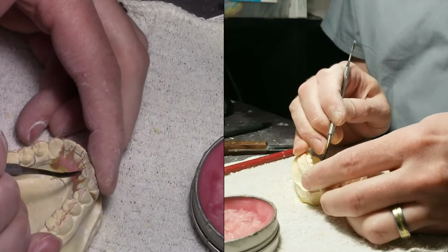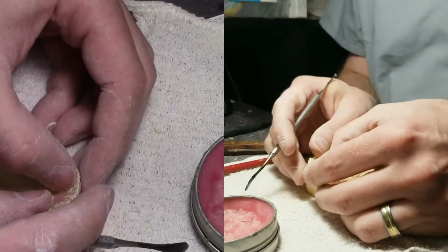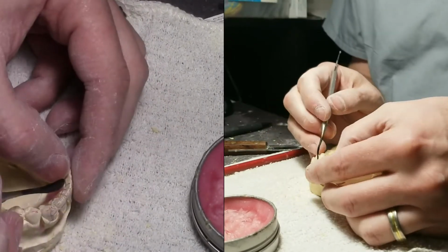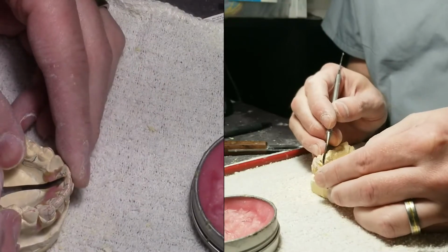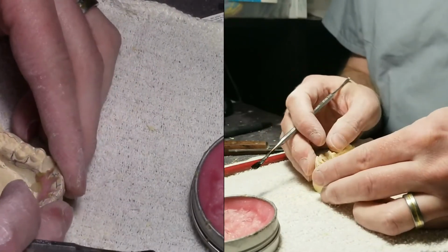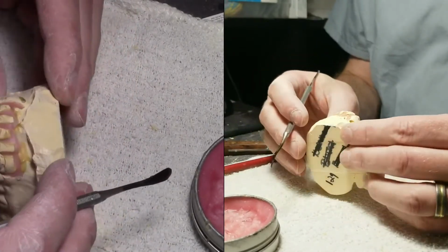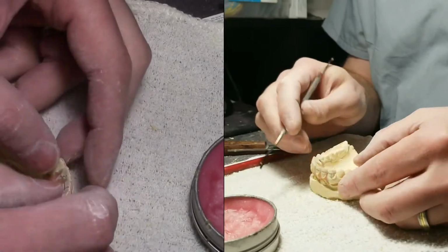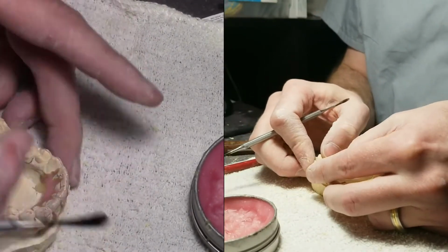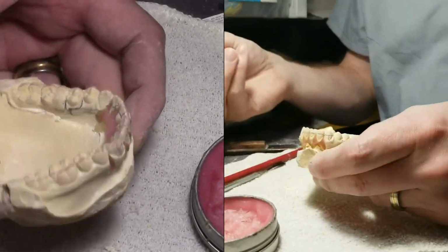Of course, nowadays you can do this digitally with a scan. Woo! That went out too far. All right, I kind of like how that looks. Again, the doctor said no stripping, which I kind of would like to do, but since I've flared everything out, usually I have enough room. So let's try this out.